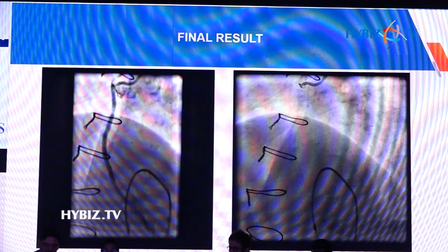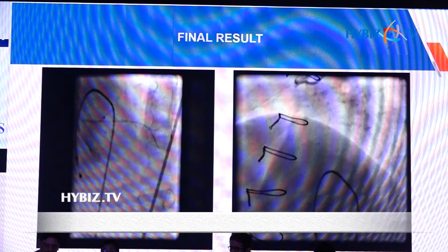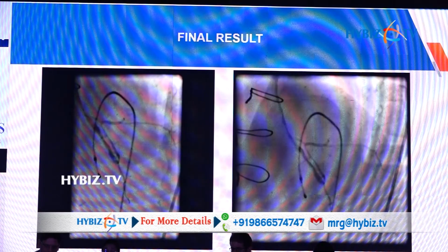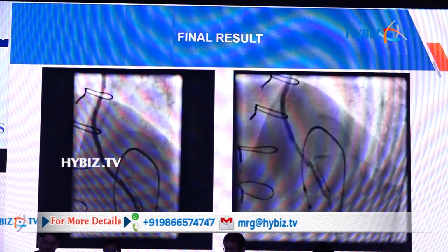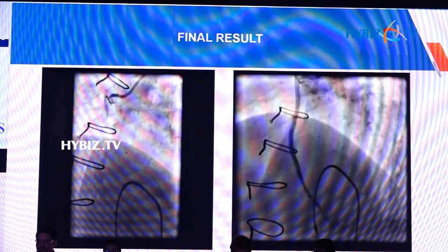And then you see the final result. So somehow it comes back, in a moment. It could be either some vasospasm due to release of molecules like serotonin, or due to clogging of microchannels or capillaries. So once it relents, you see the flow is acceptable.